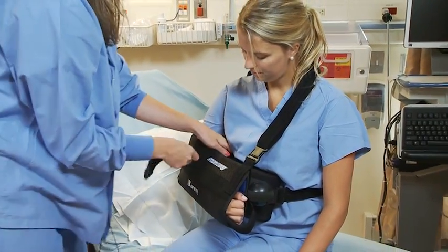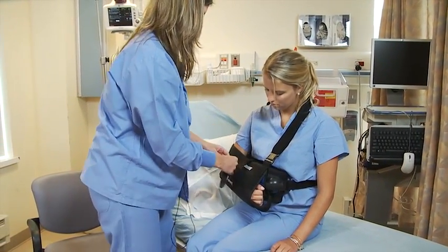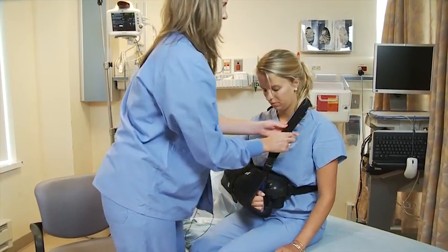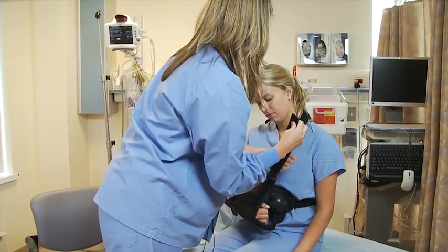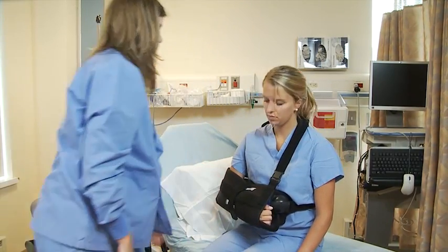You can use the strap here just to secure it. This is also helpful when you have the ice machine — it holds the little hose in place. You really want to make sure that you're lifted. How's that feel, Sarah?